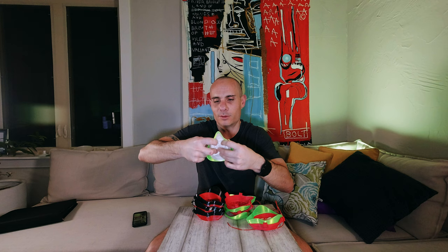So as you can see, we're using my paper towel example, but you cut that out and you pop it in here, and once you've got this in place, which is difficult to do backwards, by the way. Once you snap it in and you get it seated, it looks like that. You've got a nice solid filter there, and you pop the cover on. You're good to go.